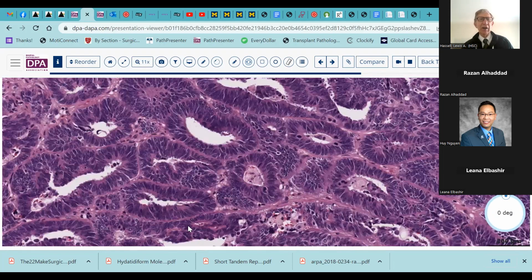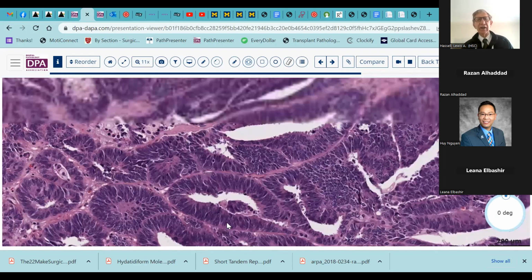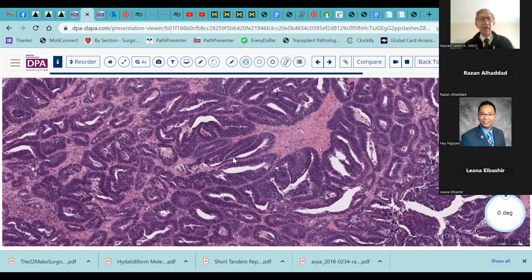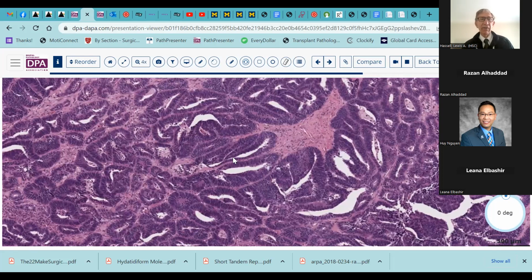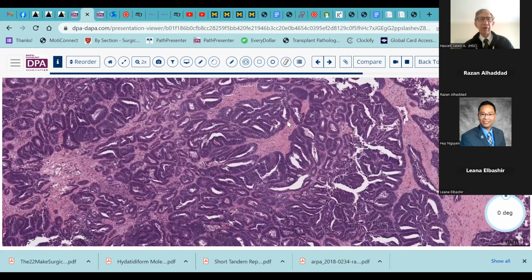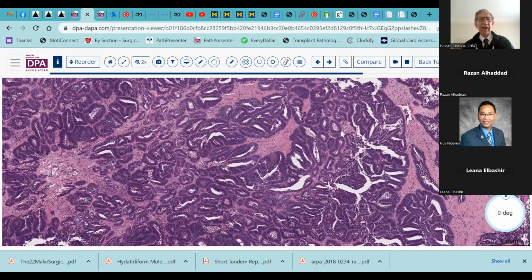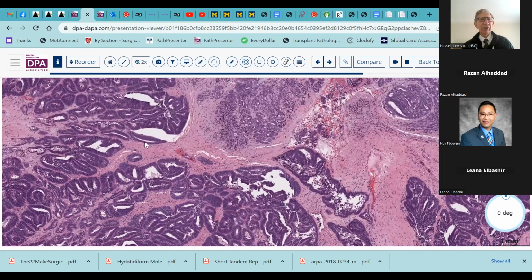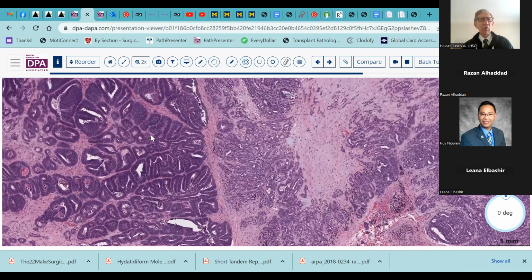This patient had a disseminated tumor that had been diagnosed as endometrioid carcinoma, because it was PAX8 positive. It was wild type p53. But the problem was that it was hormone negative. It was negative for ER and PR, and you shouldn't see that in a fairly well differentiated endometrioid tumor.